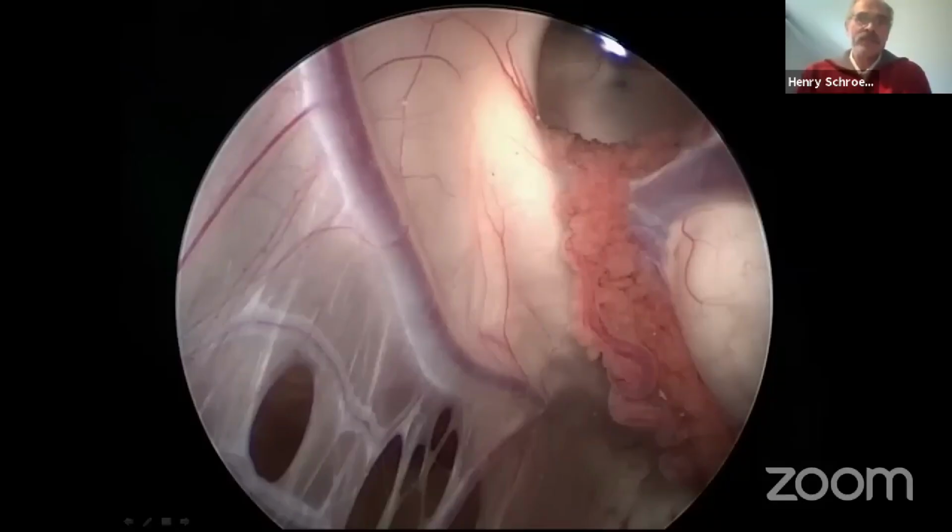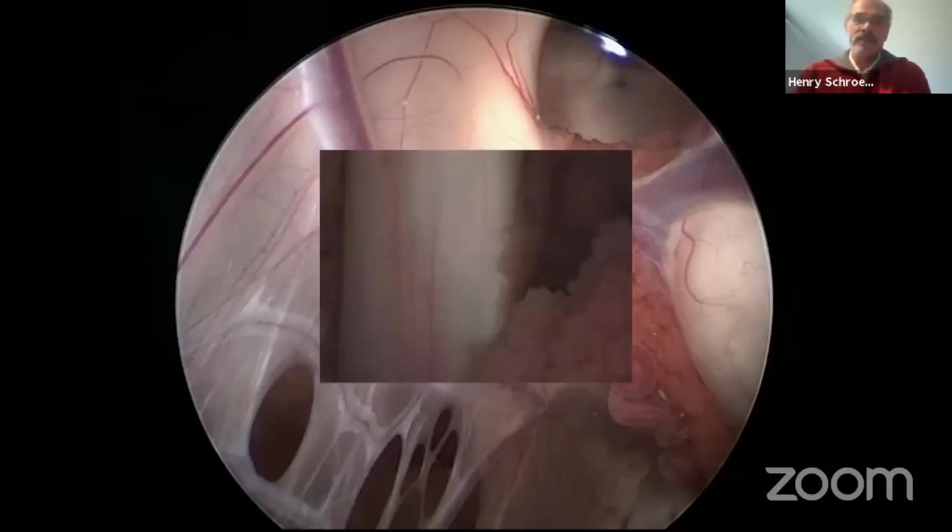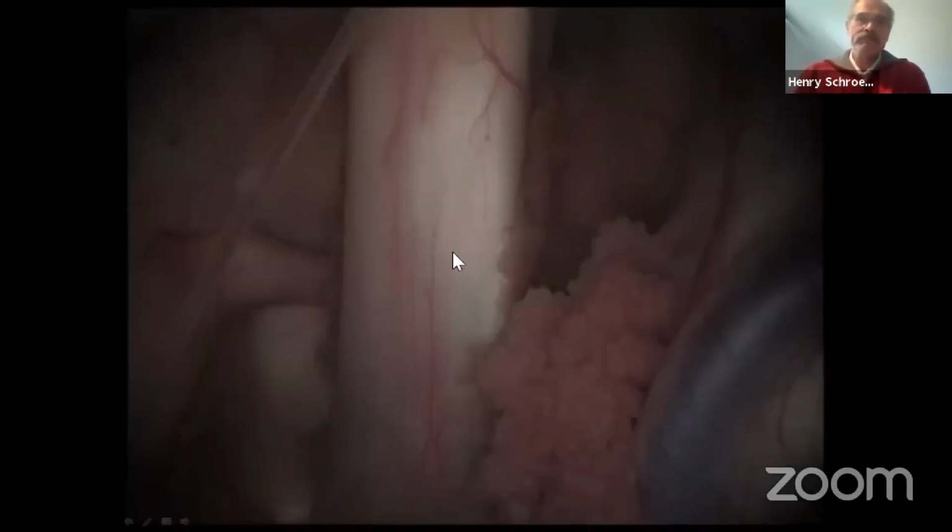When we look a little bit to the left, we see the septum pellucidum. Sometimes we have a severe atrophy with holes in the septum and only the vessels remain, a typical sign of chronic intracranial hypertension. And sometimes there is no septum and we have a cyclops ventricle.